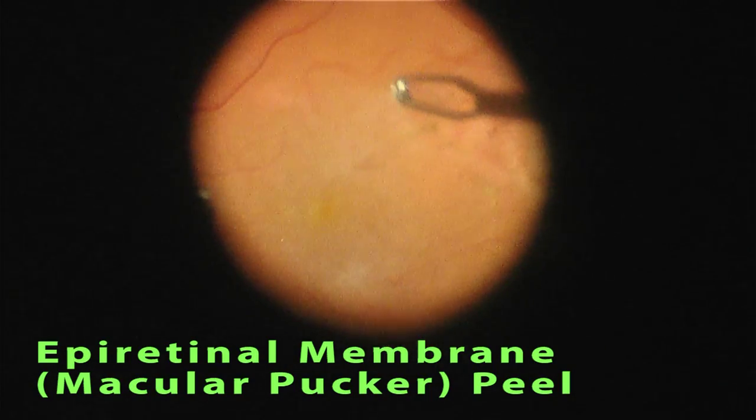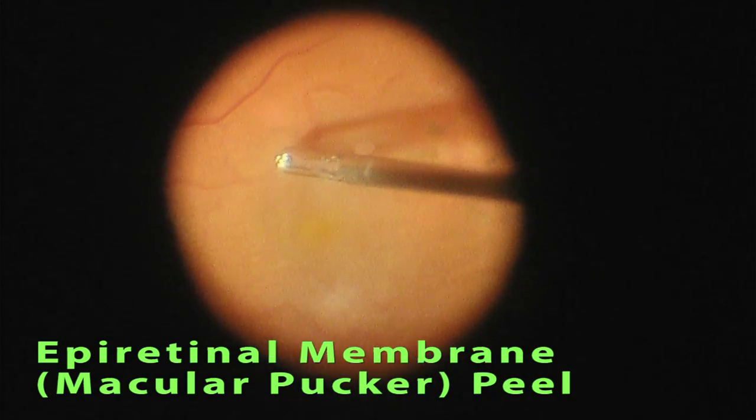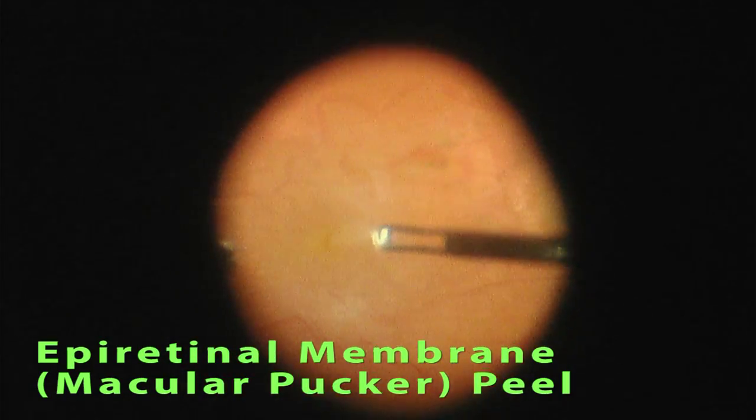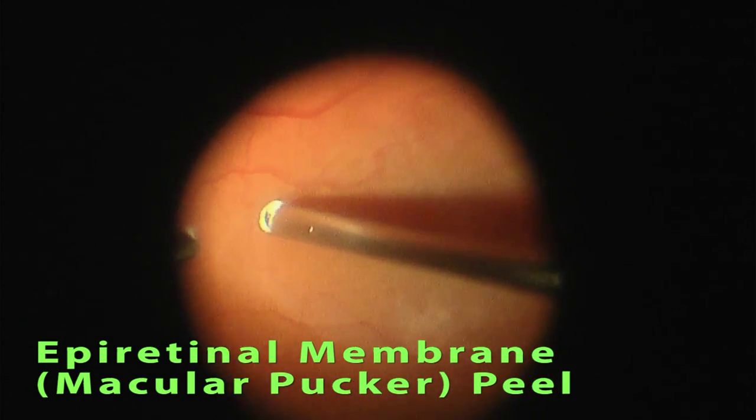The membrane is grasped and peeled, and then the edges are each grasped. By following the edges and gently pulling the membrane away from the macula, the membrane can be elevated and safely removed from the eye.